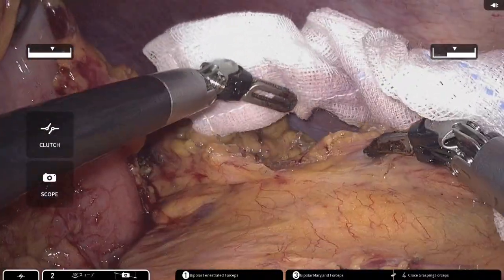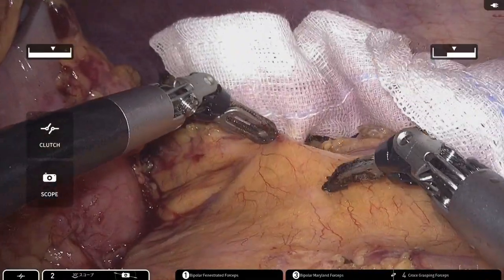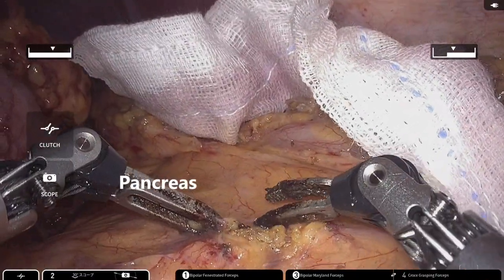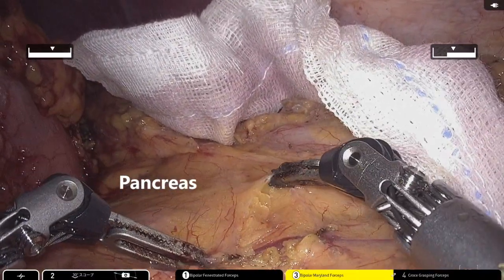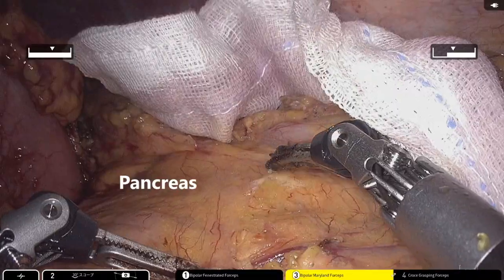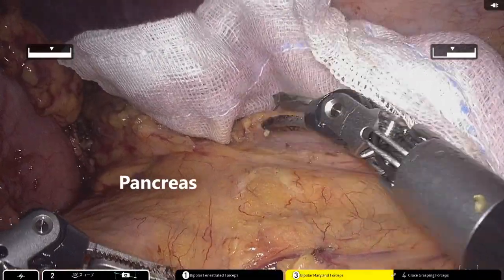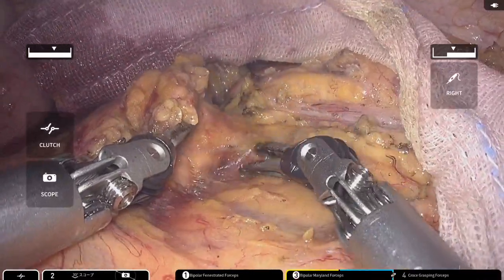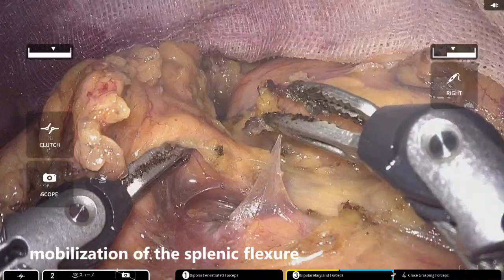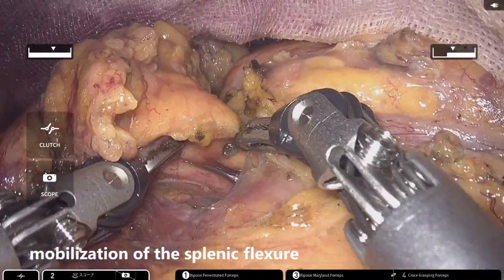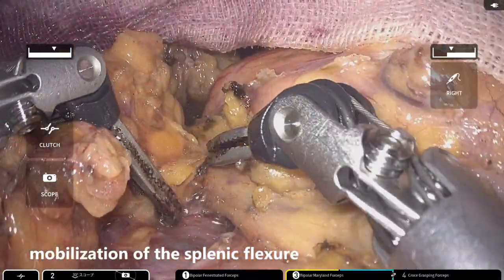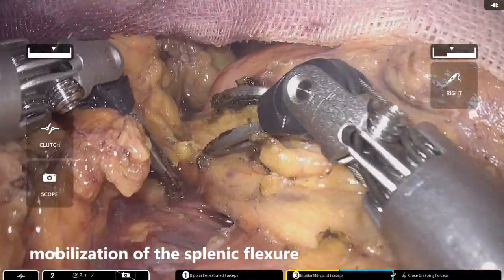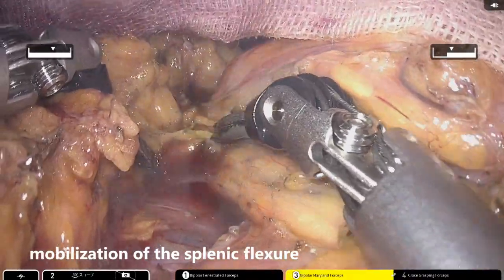The greater omentum is divided and the omental bursa is opened. Then, the transverse mesocolon is incised along the pancreatic margin and connected to the previously created dissection plane. Finally, mobilization of the splenic flexure is completed.